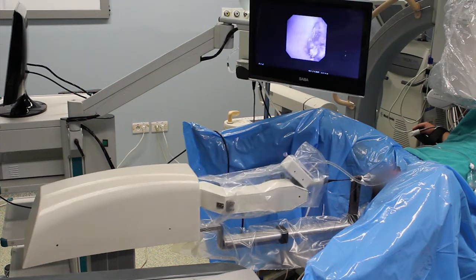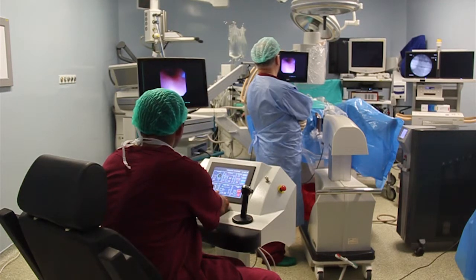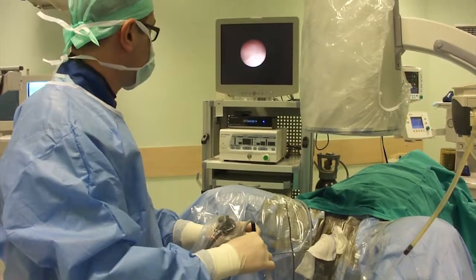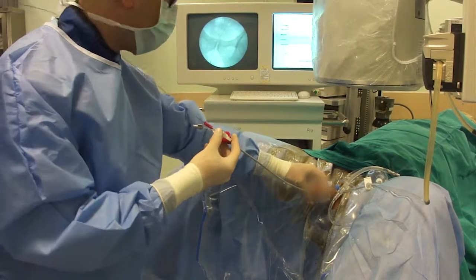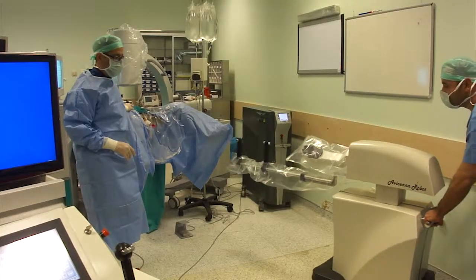The Avicina Roboflex consists of the surgeon's console and the manipulator of the flexible ureteroscope. After introducing the access sheath in the usual method, the robot with its sterilized draped arm is brought into the operative field.